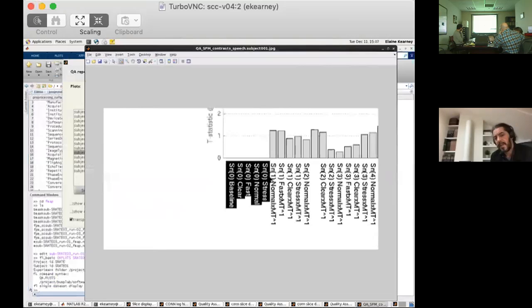So do we have a baseline condition, or is baseline kind of like the average of all of them, or do we have a separate baseline condition? There's a specific baseline condition. That's the first one listed here. So we don't have it individually. Why? Normal T.